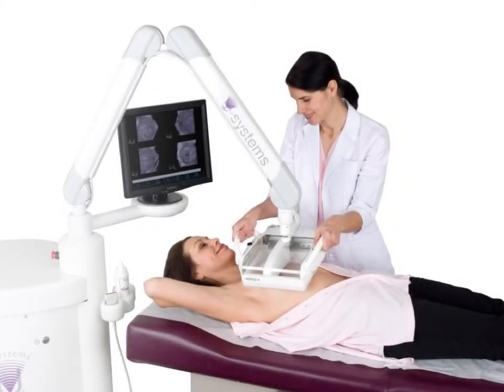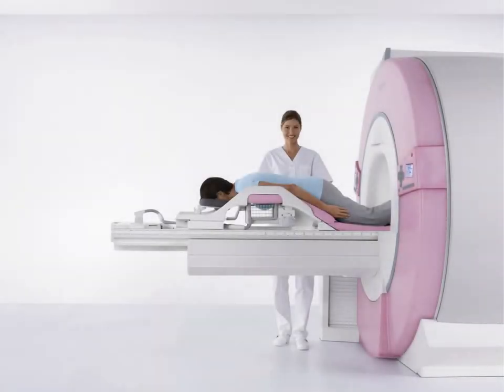For women with increased density or a slightly higher risk, we perform 3D ultrasound that covers the entire breast. For women at very high risk, we add MRI or ultrasound as the patient prefers. In very high risk women, MRI is slightly better, but some women do not like MRI. We then look for additional cancers, that is, cancers that are not seen on mammogram.